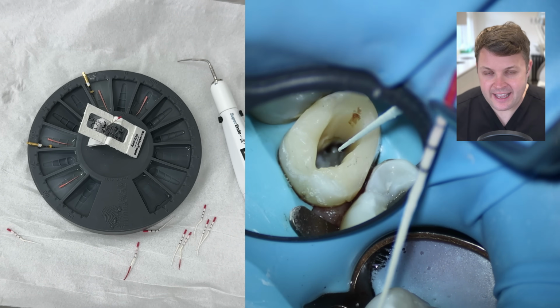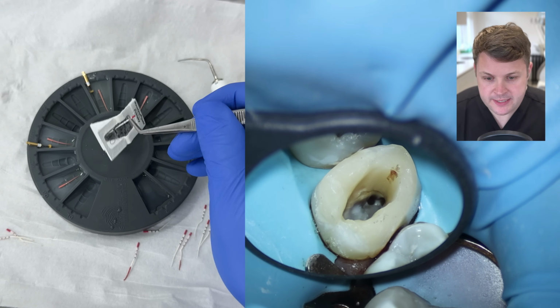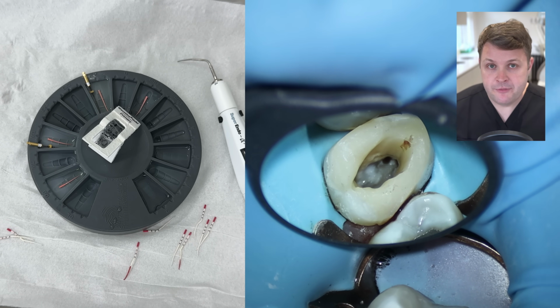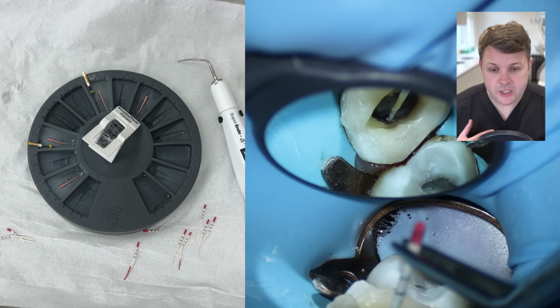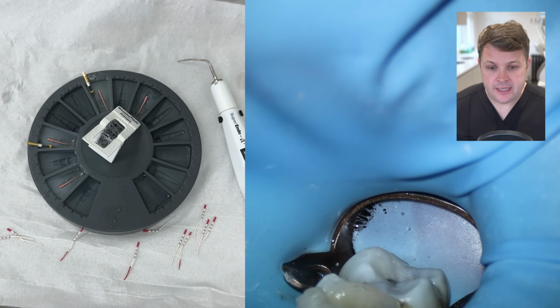But again, it's a significant amount of bleeding. And also at the same time, when I place the paper cone in the DB, the patient jumps ever so slightly, indicating that they are not numb. So given the fact that the patient's not numb, and also we've got a bit of bleeding, I just change tack, I numb the patient up again, and then I re-irrigate.